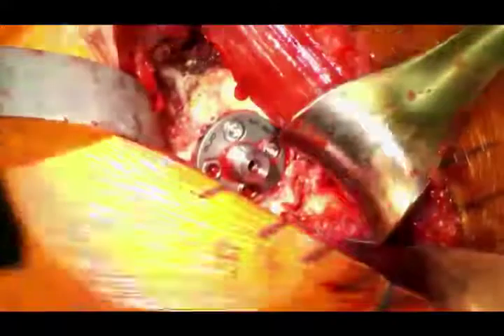We're getting very little bleeding, which is nice. That might be the tranexamic acid, or my anesthesiologist. I try to get hemostasis as quickly as possible and pay attention to anything that might bleed. During the deltopectoral approach, I take time to coagulate any small tributaries from the deltoid vein — I think that's really important for avoiding hematomas postoperatively.